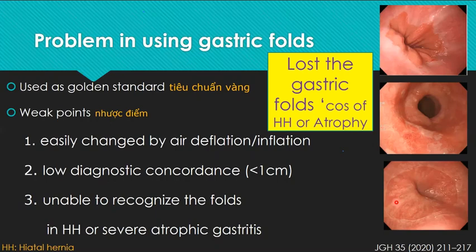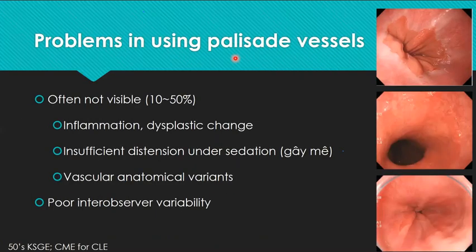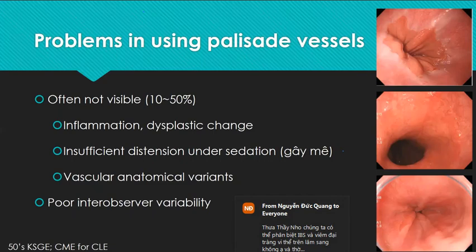On the other hand, if we follow Japanese doctors and adopt palisading vessels, sometimes or many times they are very hard to visualize. In particular, nowadays we have a lot of GERD. If the air is not good enough, oh my goodness, it's almost impossible to check the palisading vessels. So there is still a problem with CLE-like or CLE.